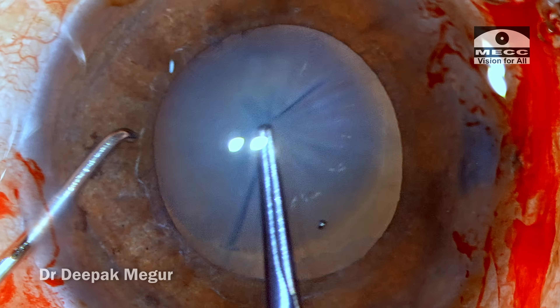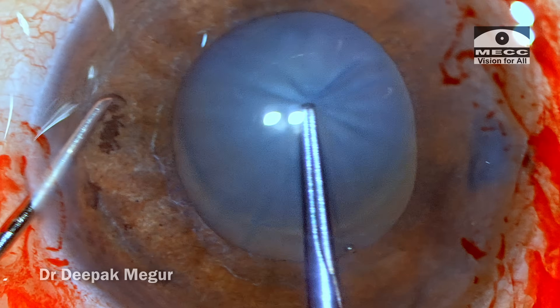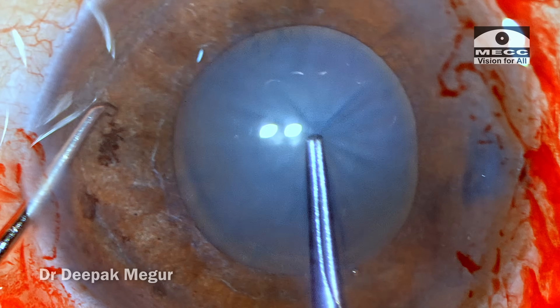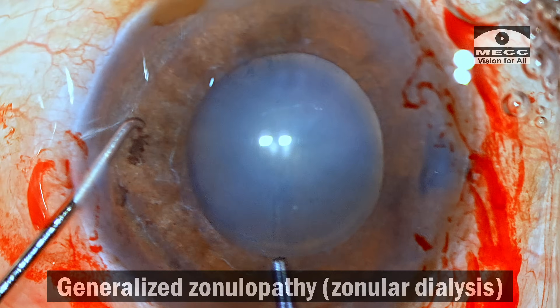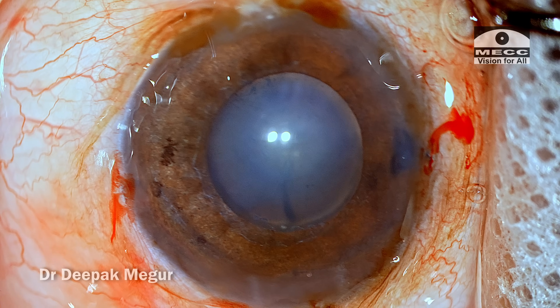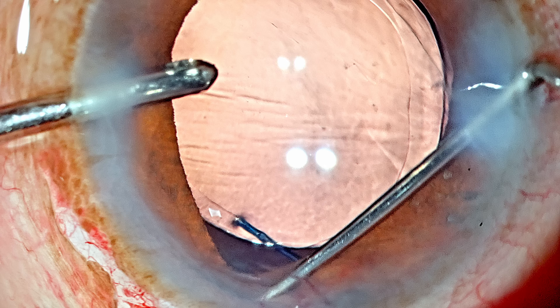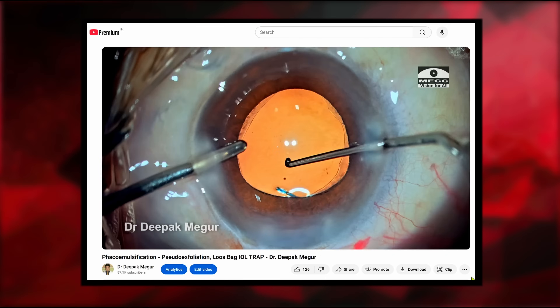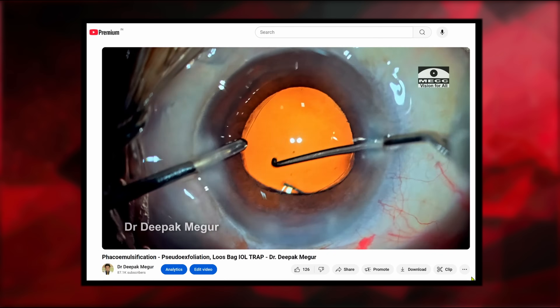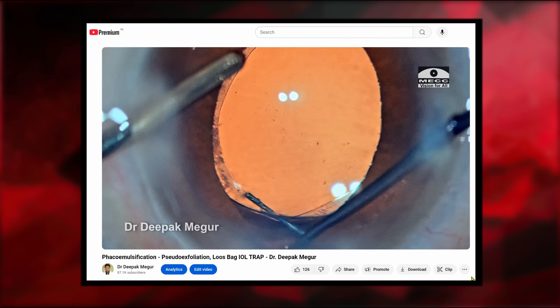As I begin to move the lens a little bit, you can see the entire lens is wobbly. This is a cause for concern — this is a case of generalized zonulopathy, which we most commonly encounter in eyes with pseudo-exfoliation. My go-to approach has been the IOL trap technique and I've published many videos on this channel for the same. This technique does work well and let's see how things are to be done.